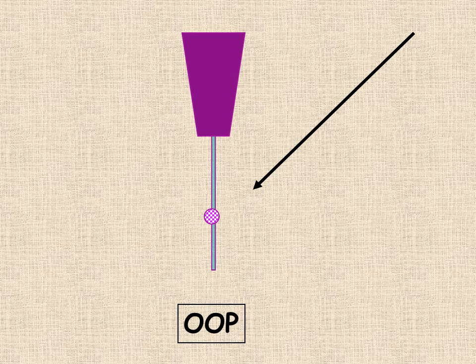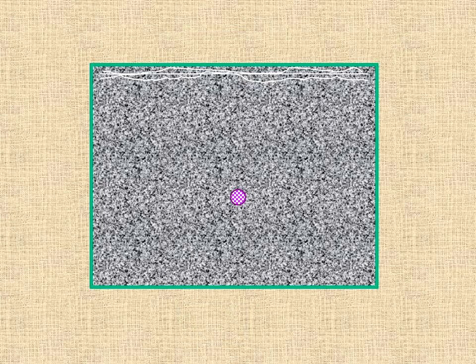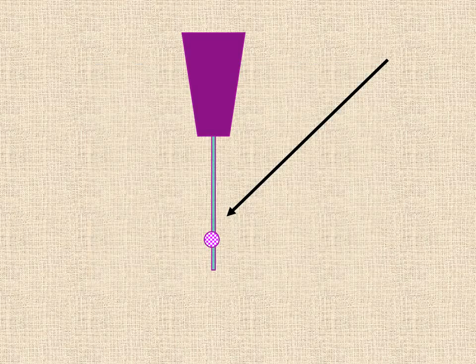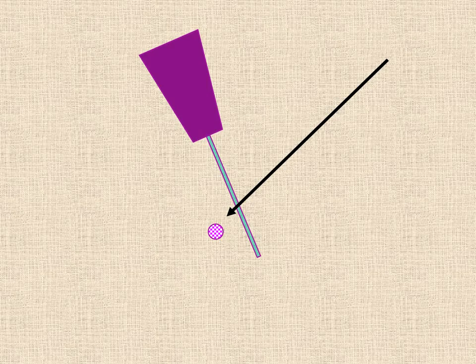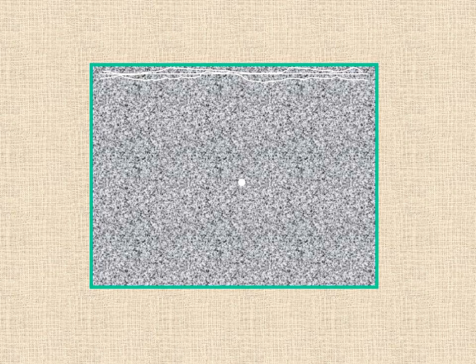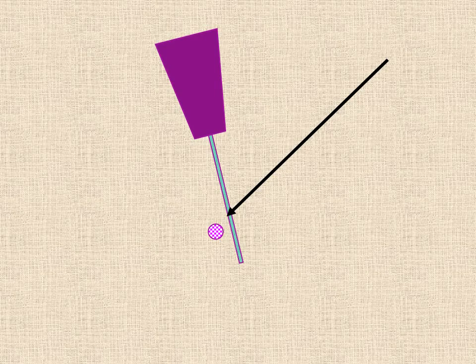If the needle is approaching out of plane, we will not see the tip and the nerve in the same picture until the needle is very close to the nerve. So here we have an ultrasound picture of the nerve with no sign of the needle. If we angle our beam up towards the shaft of the needle, we can now see the needle, which appears as a white dot in the middle of the screen, but we've now lost sight of the nerve. If we move our beam down the shaft of the needle until we get just to the very tip, what we'll see with this picture is a double dot, which is the bevel of the needle, and this shows us where the tip of the needle is. So as the needle approaches the nerve, we are walking the beam on and off the tip to maintain a view of the tip.